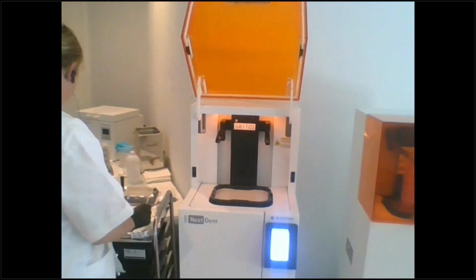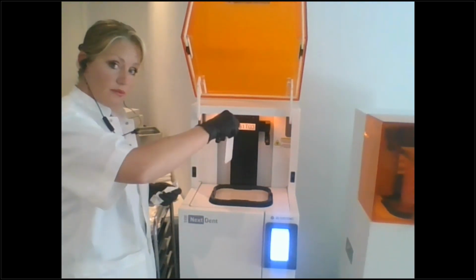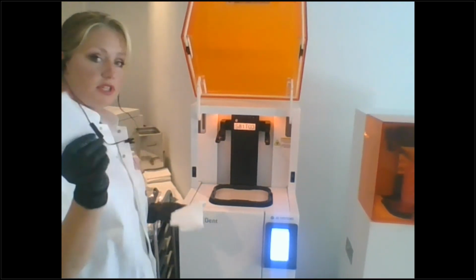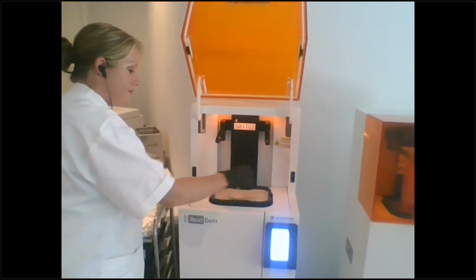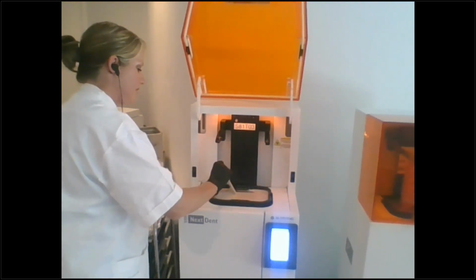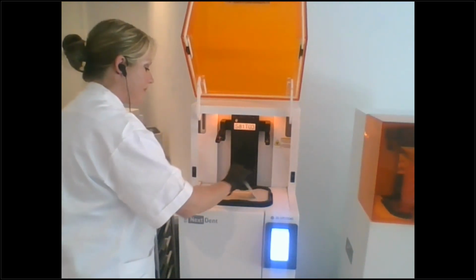And then you can stir your resin. And when you stir, you're not going to scrape or anything like that. I don't ever have my comb up like this. Use the comb that we sent you, and you'll be just fine. It's nice and smooth. There's no rough edges on it. And just go sideways like this and give it a stir. No pressure. There's no reason to put any pressure on there. But you'll be able to see that your resin needs a little mixing if it's been sitting for an hour.